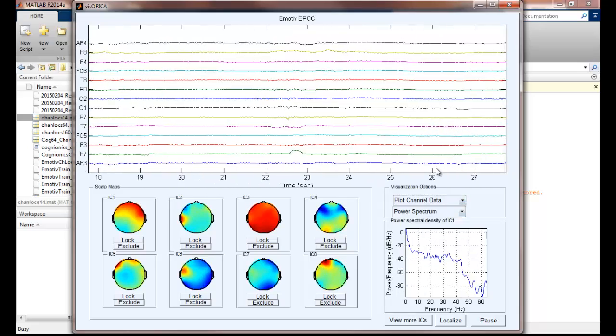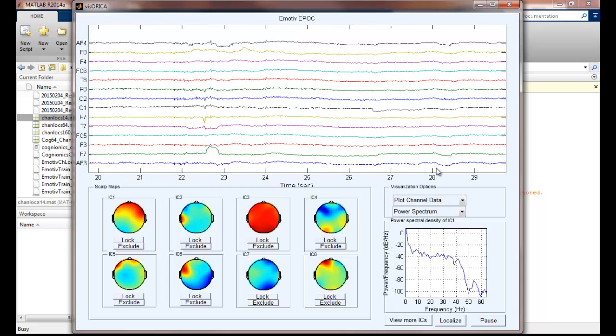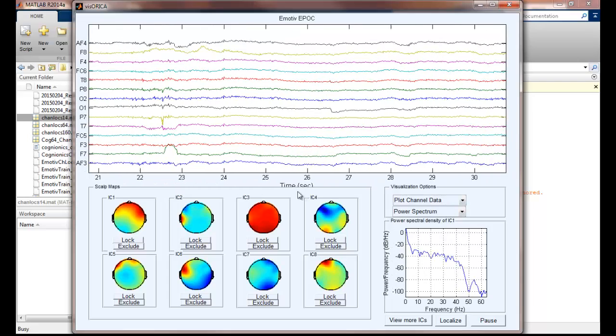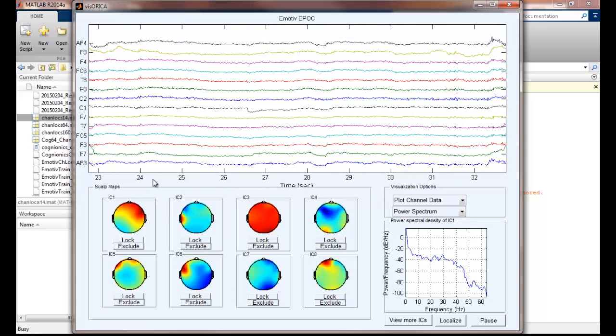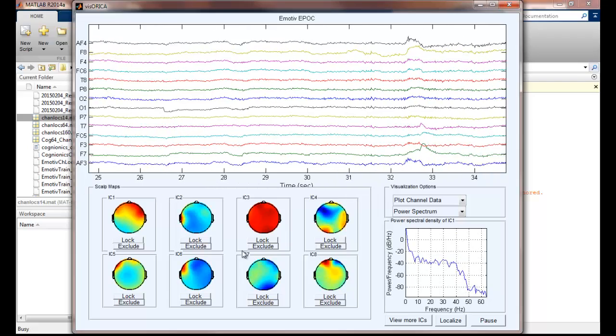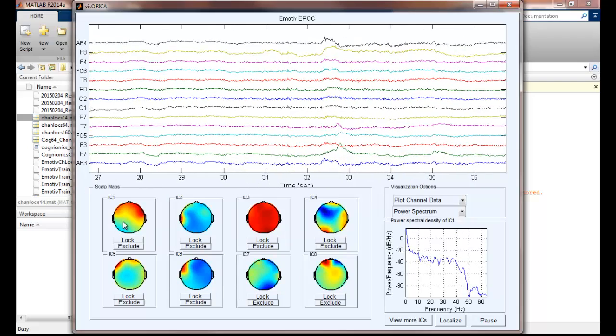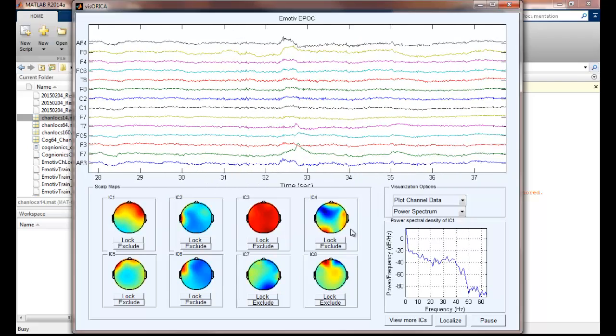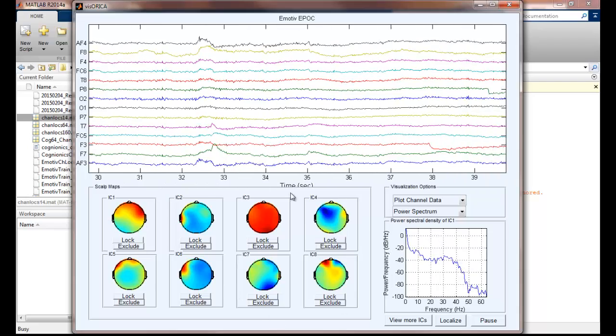The bottom left panel shows 8 scalp maps of the online decomposed independent components. We can see that the scalp maps are computed and updated in real-time. Since we don't use training data, the components are still converging.